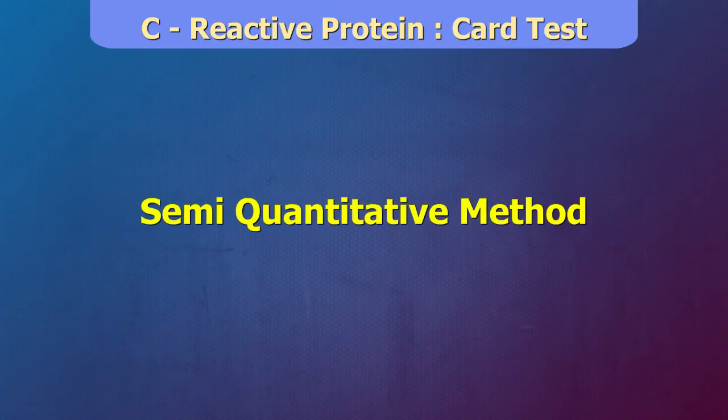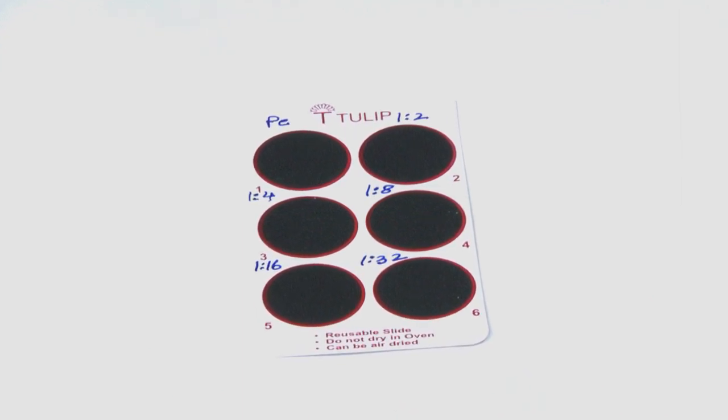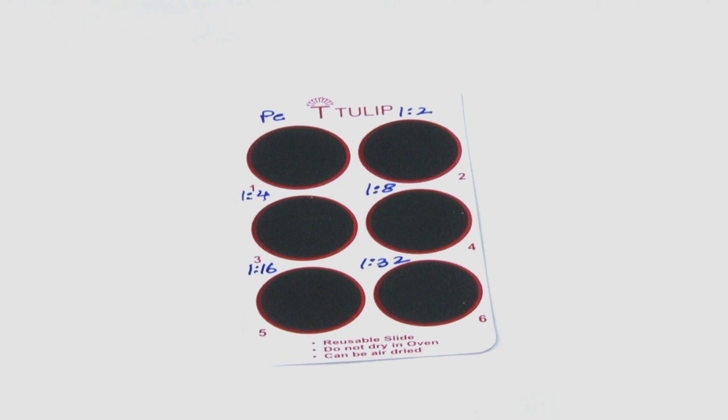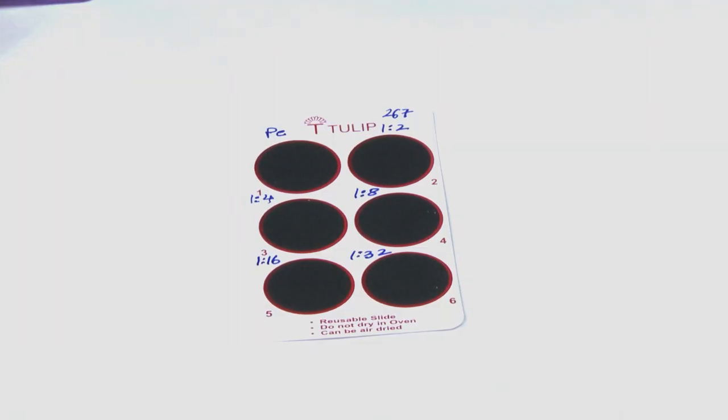Semi-quantitative method: using isotonic saline, prepare serial dilutions of the test specimen positive in the qualitative method. Take a reaction slide and label it with patient identification. Mark reaction circle 1 as positive control and the remaining circles from 2 to 6 as 1 in 2, 1 in 4, 1 in 8, 1 in 16, 1 in 32 for the respective dilutions.